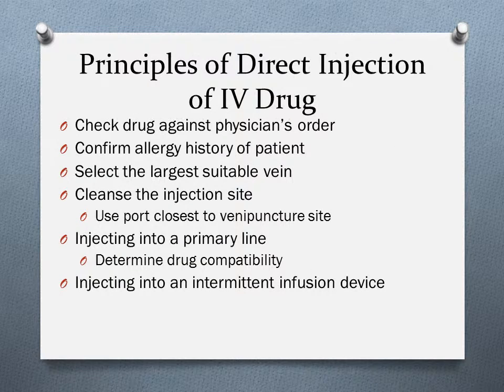Principles of direct injection of IV drug: you always want to check the drug against the physician's order, making sure that you have the correct drug, the correct form of the drug, and the correct dosage. Confirm patient identification, and as I've said before, always wash your hands with IV therapy. Wear protective gloves. Select the largest suitable vein if you do not already have IV access.